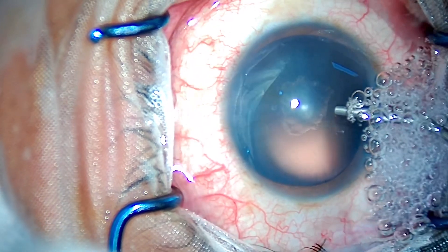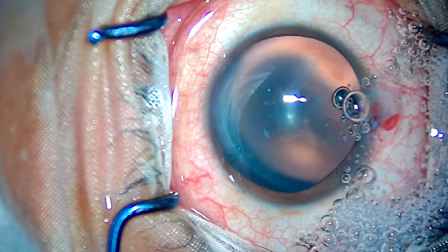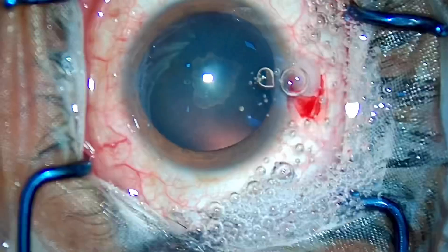As you can see, I have started with the steps which you might already be knowing — making the side ports and cutting the limbal vessels for good long-term healing of the wound.